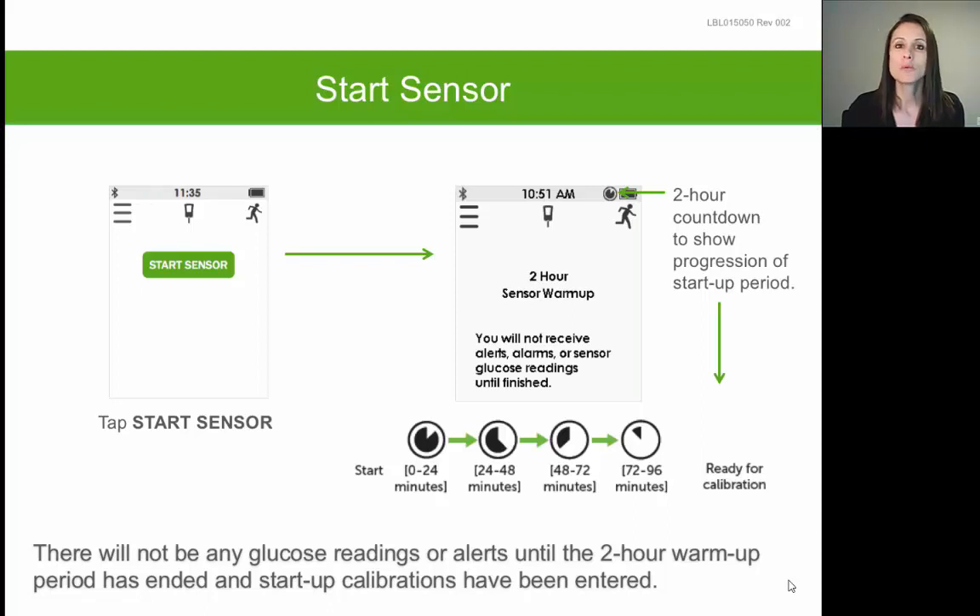Once that Bluetooth symbol becomes solid, you can tap Start Sensor. Make sure you wait up to 10 minutes after inserting a sensor and transmitter for the Bluetooth symbol to stop flashing and become solid before you select Start Sensor. Tapping Start Sensor launches the two-hour warm-up, represented by a little pie chart in the upper right-hand corner. Every time you insert a new sensor every seven days, it will always go through this two-hour warm-up where you will not see any glucose readings and will not get any alerts.